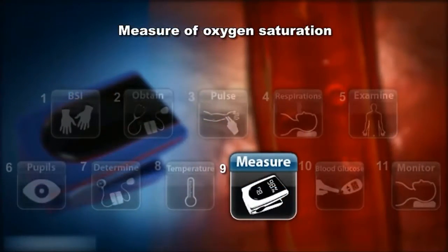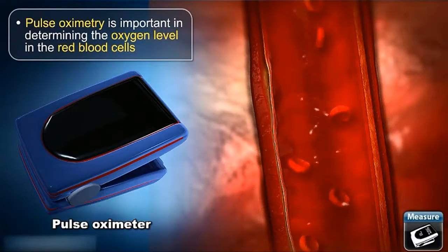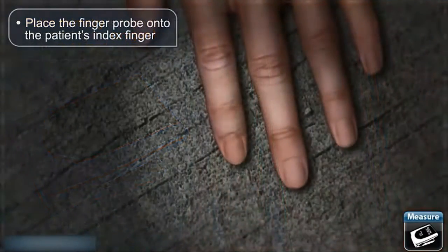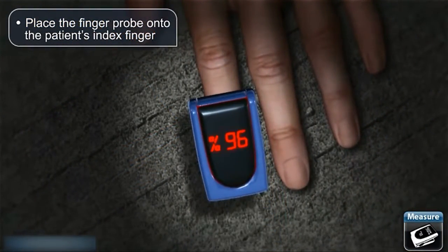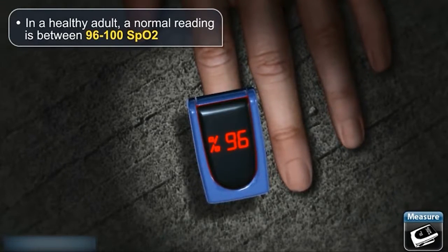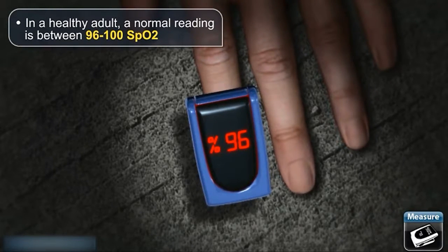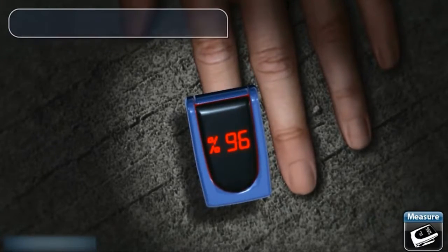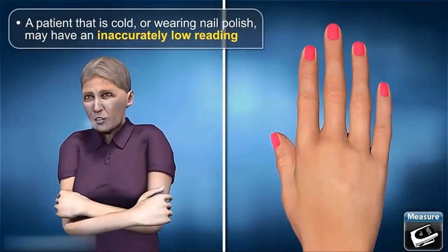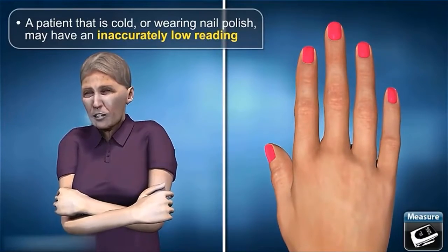Measure of oxygen saturation. Pulse oximetry is important in determining the oxygen level in the red blood cells. Place the finger probe onto the patient's index finger. In a healthy adult, a normal reading is between 96 and 100% SpO2. Lower readings are signs of hypoxia. A patient that is cold or wearing nail polish may have an inaccurately low reading.